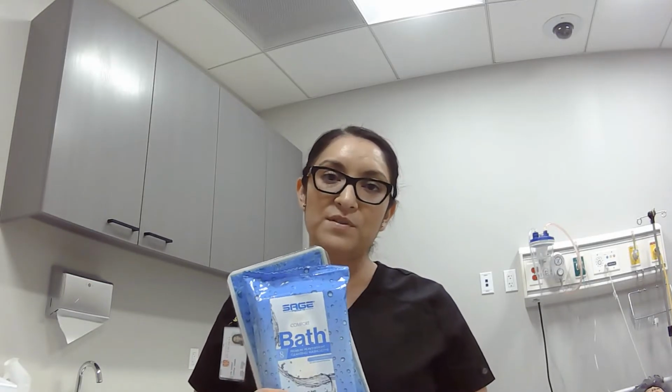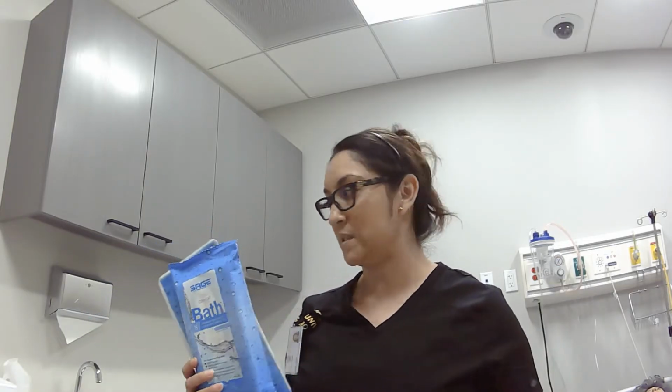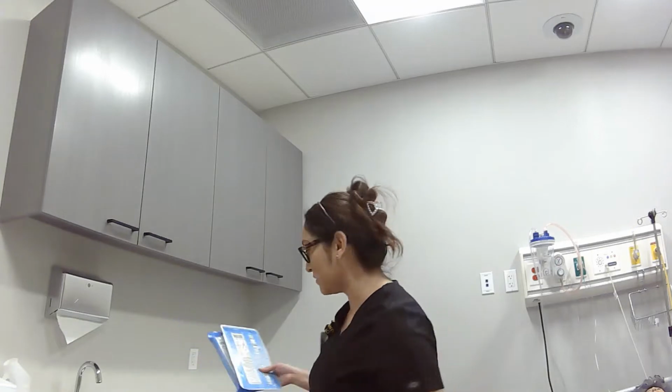So these bath wipes are going to be used for peri-care. So we're going to clean the perineal area prior to insertion because we want to make sure that we're removing all of the bacteria, any skin flora around the perineal area, so that way we're not introducing bacteria into a sterile environment, which is their urethra.